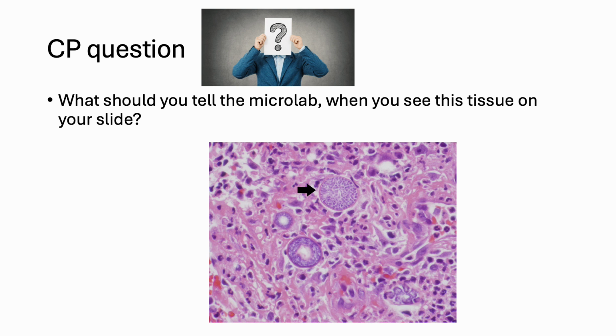The reason is the cocci can be very contagious, and when they open the lid, the microorganisms will spread into the entire lab and cause contamination. They need to do a lot of decontamination. It will be very time consuming and very dangerous for the lab staff. So it's good to remember that.